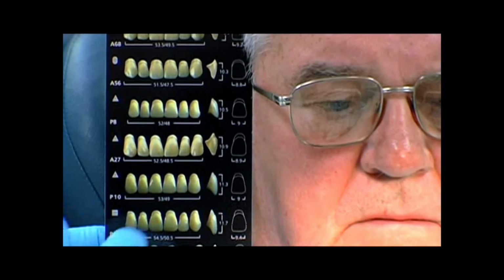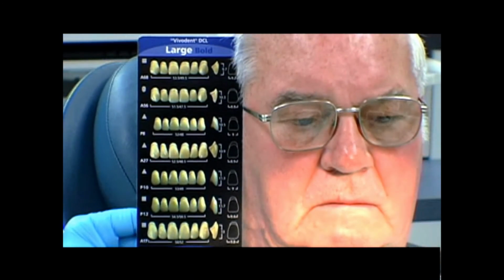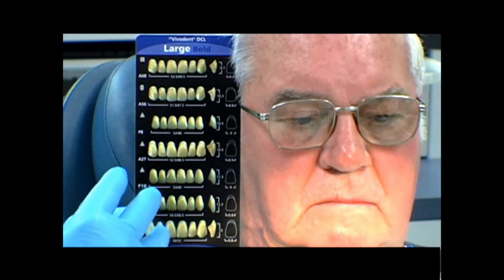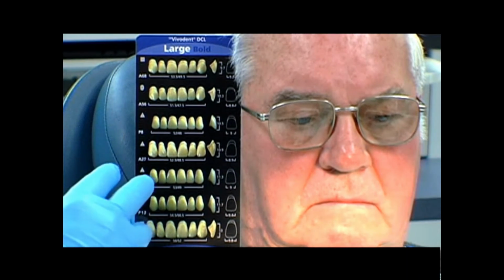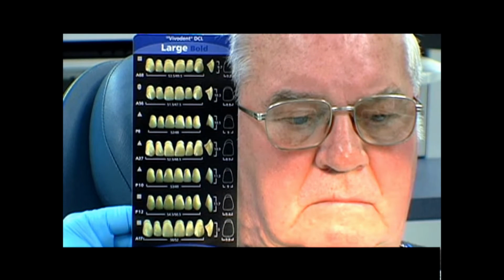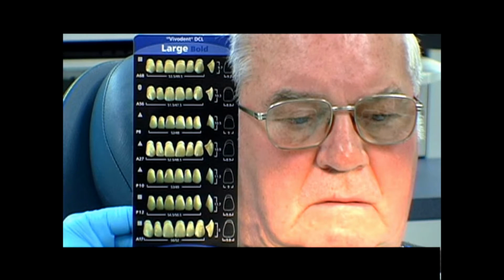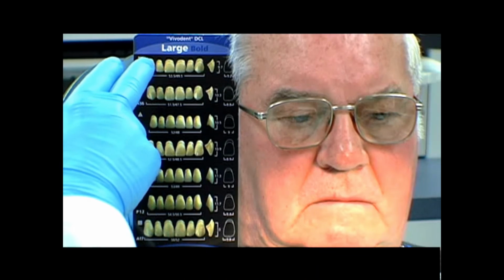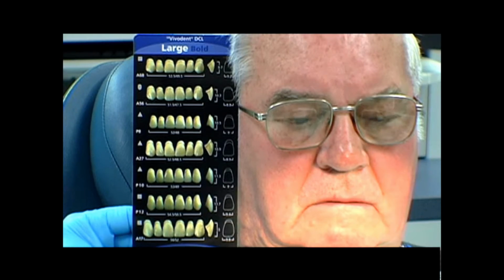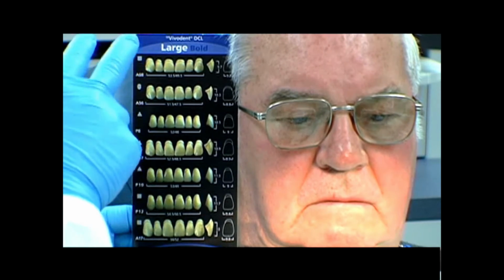The 1 card is isolated and placed in juxtaposition to the patient. This gives the dentist and patient the opportunity to view a handful of selected molds immediately adjacent to the patient's face. Although the final decision of mold selection is somewhat subjective, it is greatly facilitated by having only several molds from which to choose.